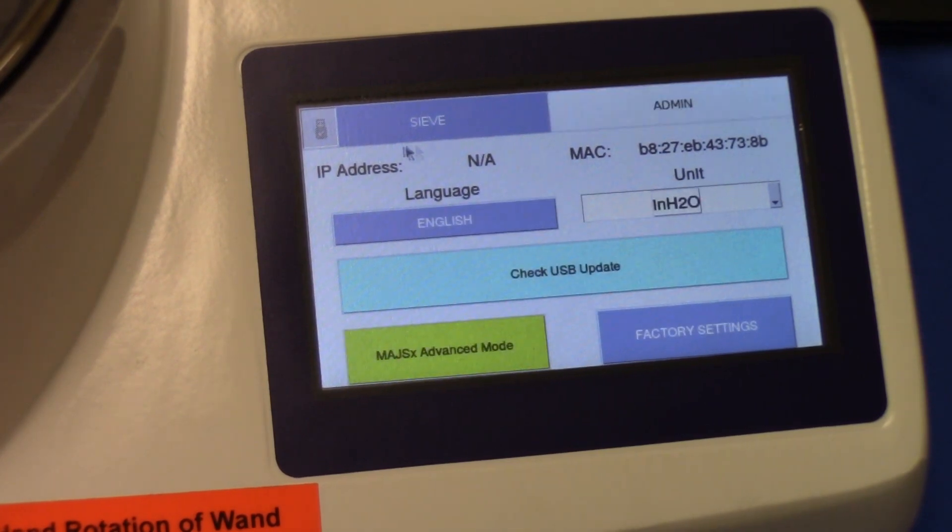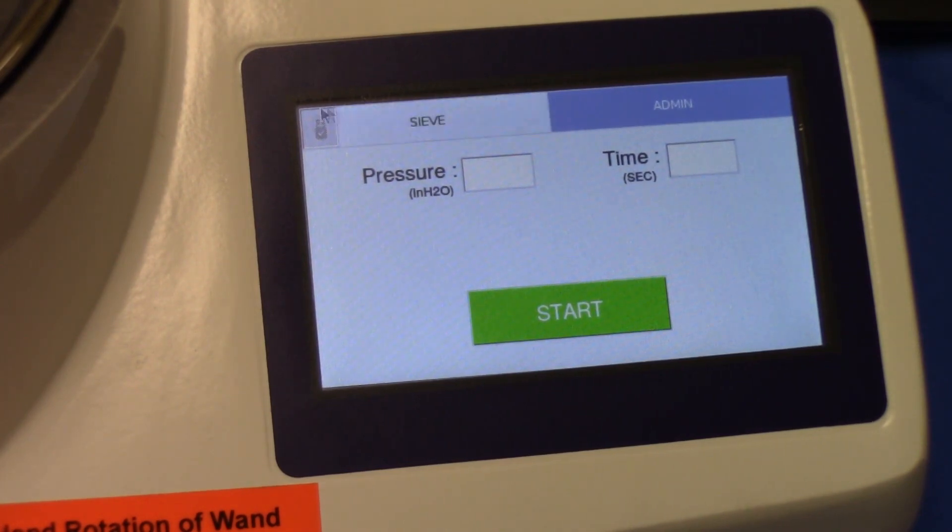If connected to a network, the IP address would be displayed here, along with the MAC address of the unit. These are mostly for our reference so we can identify and keep record of every machine sold and shipped from Hosokawa Micron Powder Systems, to keep track of what has been installed. You may also see a grayed-out USB icon — that confirms a USB jump drive is not attached. If it were attached, it would appear bold black.